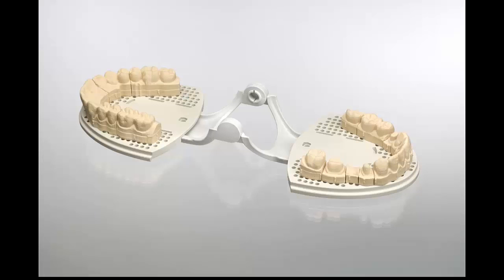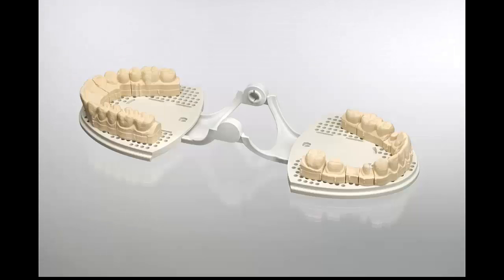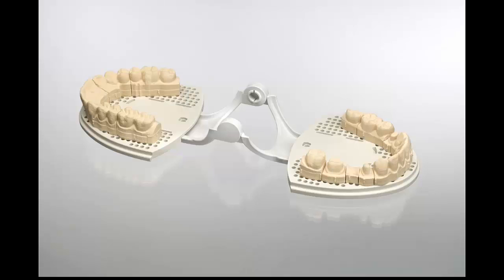I didn't pay that because we got that digital, and then you have to pay for materials and pay the wage, the labor for someone to pour that impression and to cut and trim and ditch the dies. All that you can do digitally. So I know even the SLA models, the cost for us for a lab here in Ottawa, it's less than having someone here to pour them and cut them and trim them. So the cost is minimal, and you can reuse the base plates, you can reuse the articulators if you wish, if you have access to that.